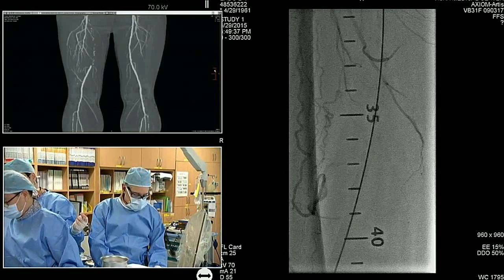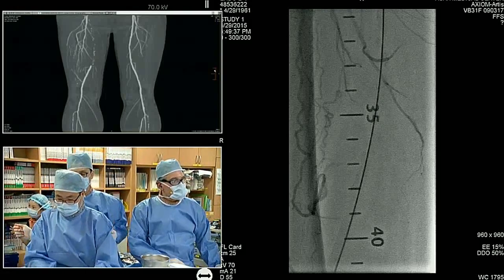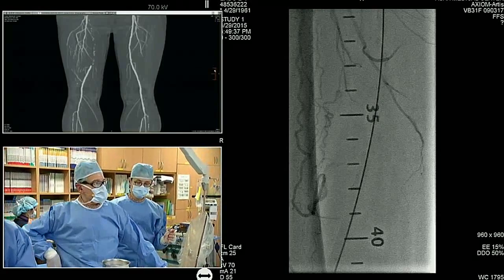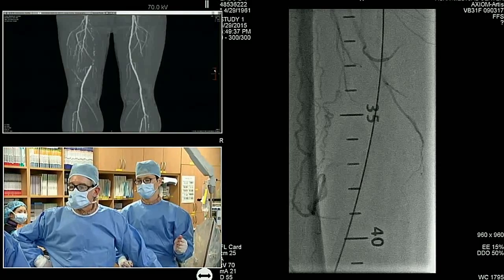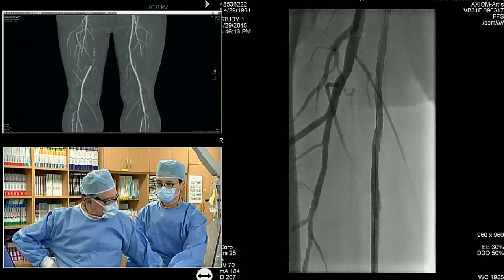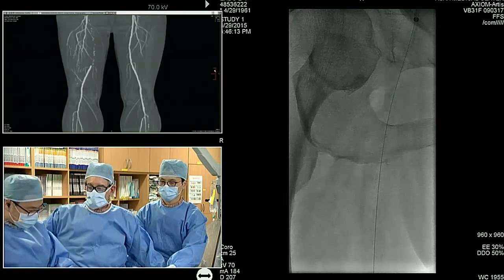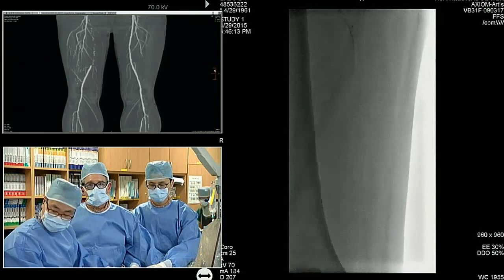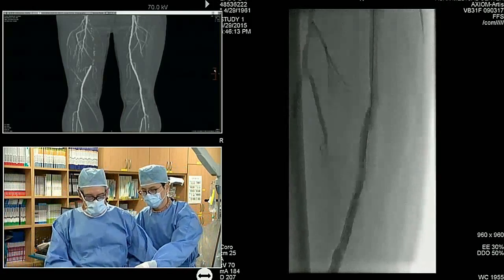Dr. Bersin, I am Yokoi from Japan. In Japan, the drug coating balloon is still not available, so very limited experience in Japan. So please tell me the technique of the DCB. My question to you, this case is CTO, that Dr. Heuser's case is ISR. Depending on the region, do you usually change the inflation time and the inflation pressure as a technical point? Similar pressure or similar inflation time?